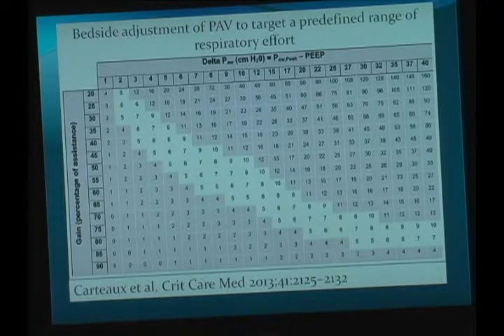But you also have to take into consideration that that can be a normal work of breathing, and it can be very exhausting for a very weak patient. So sometimes these kinds of approaches are good for fit patients, but can be a wrong decision in very, very sick patients. Because even trying to sustain a normal work of breathing for a very weak patient can be very exhausting.